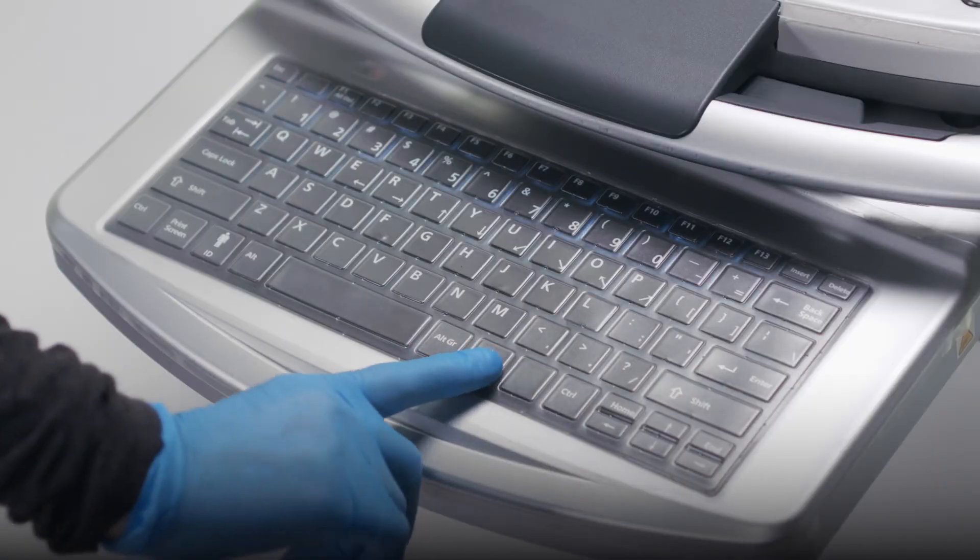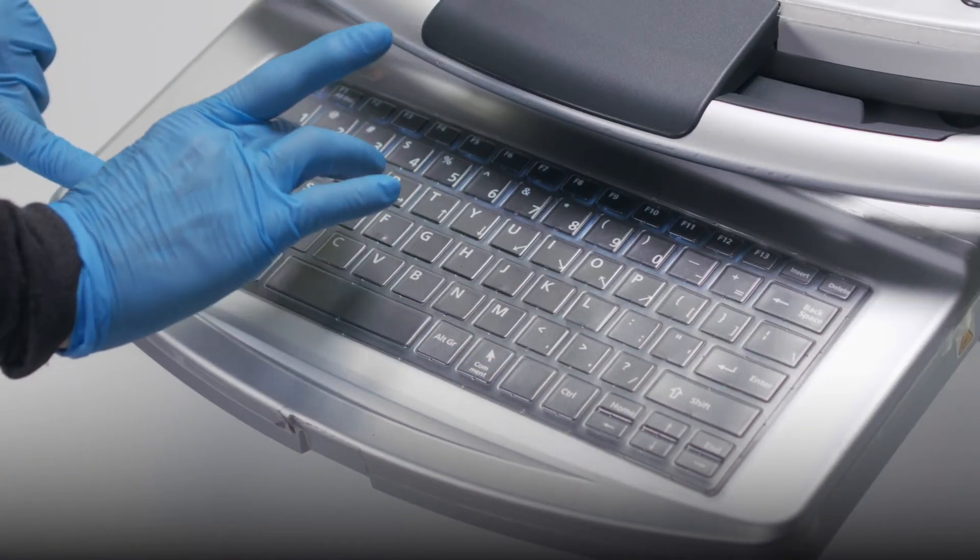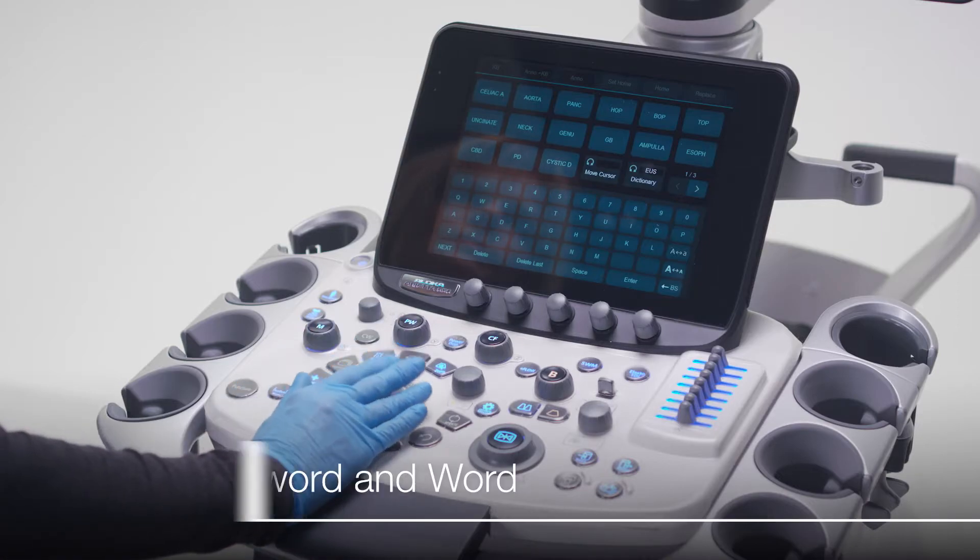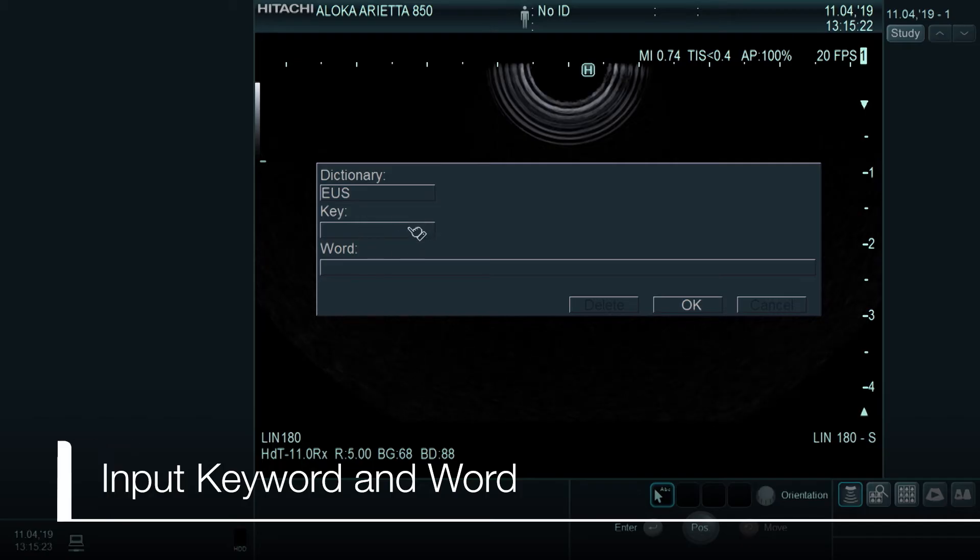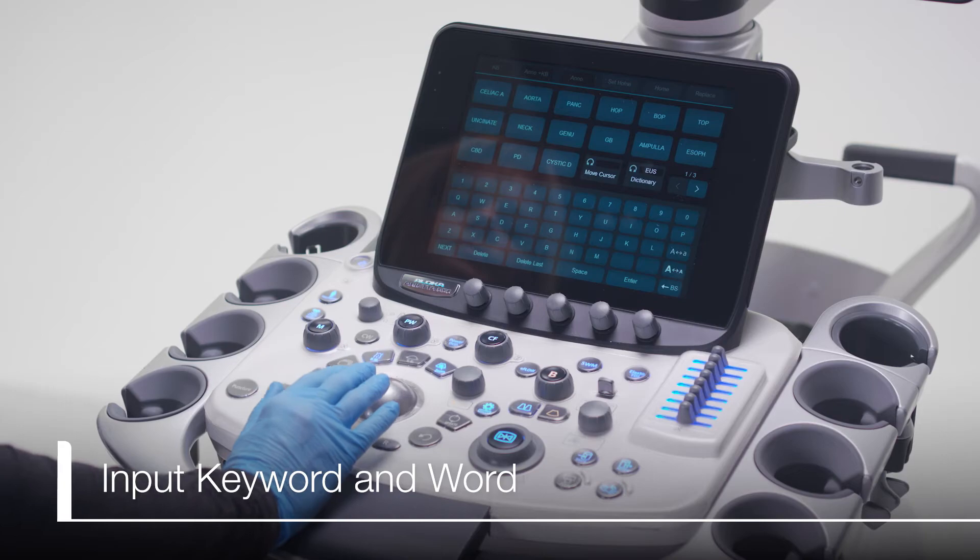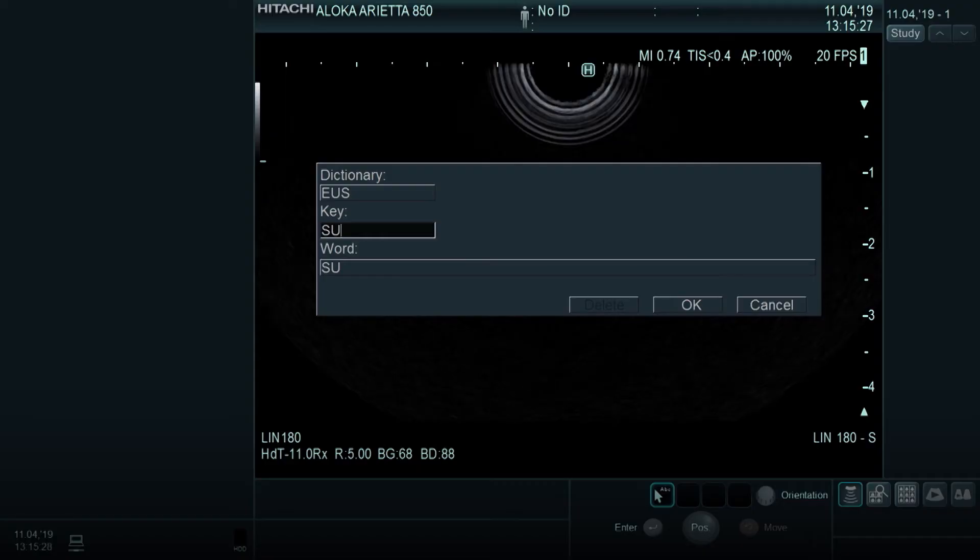Then press Ctrl D on the keyboard. Use the trackball to move the cursor to the key space and hit the Enter key. Type the keyword you would like to use. It can be up to 8 characters.